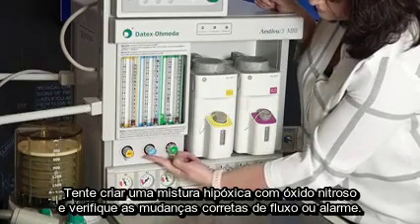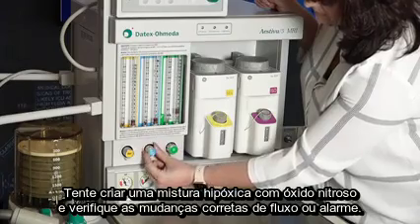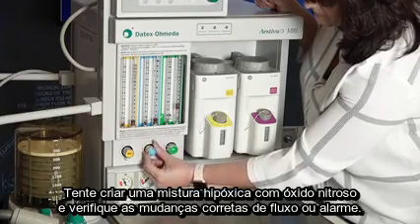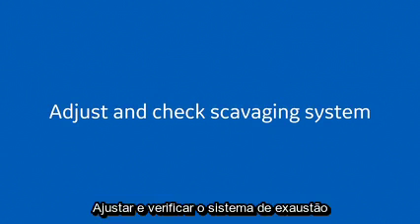Attempt to create a hypoxic oxygen-nitrous mixture and verify correct changes in flow and/or alarm. Adjust and check the scavenging system.